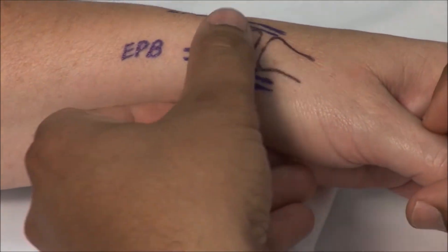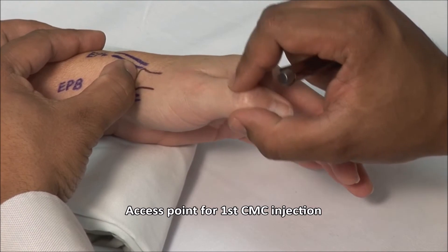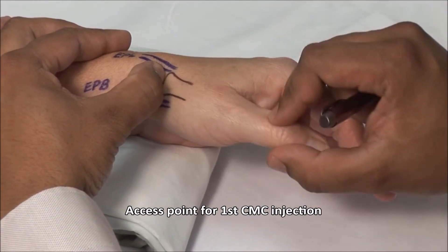Palpate the joint space while flexing and extending the thumb. You can use your thumbnail or a retractable pen to mark the joint space for injection.